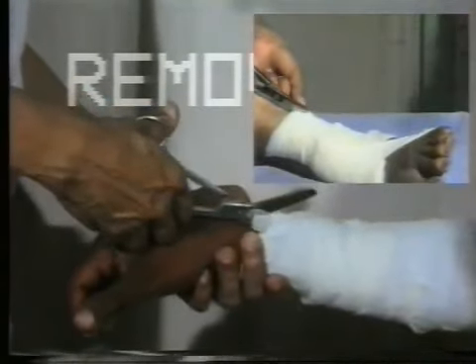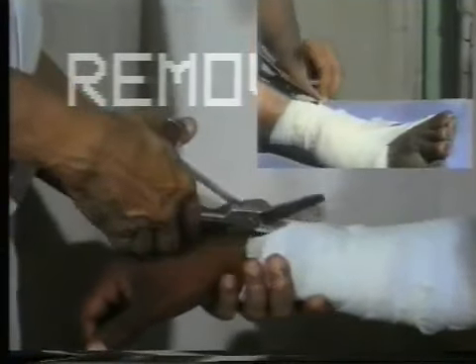The most comfortable way to remove a large bandage is to cut it with a bandage cutting scissors and remove it as a single turn. The bandage cutting scissors are special angulated scissors whose lower blade is longer with a blunt rounded tip so as to protect the skin from injury.